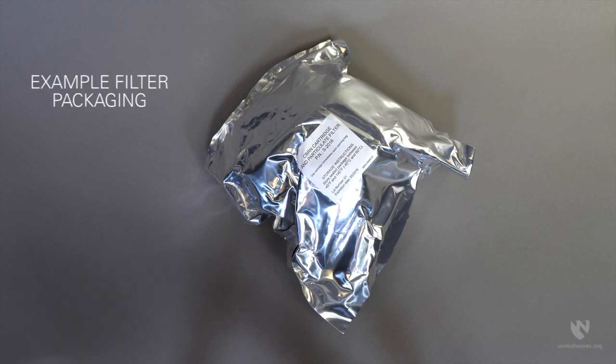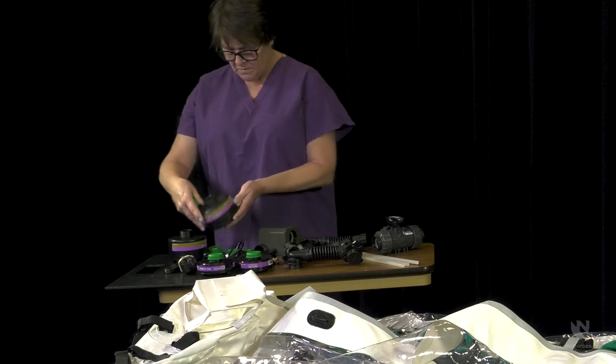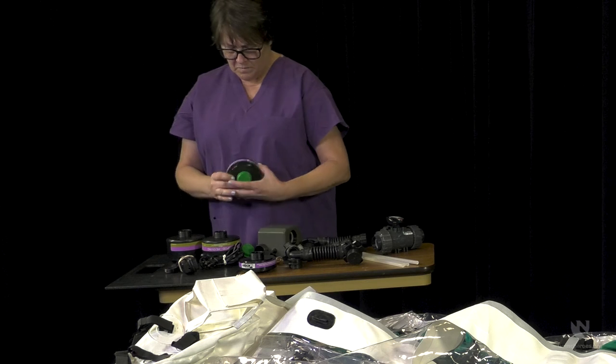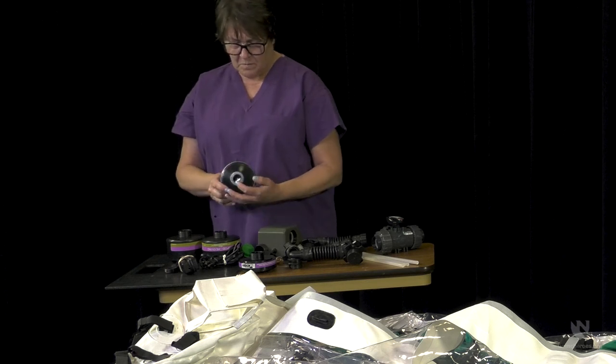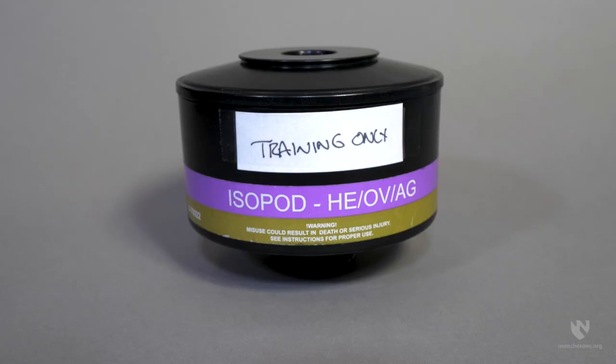Do not remove filter packaging unless you are ready to use the filter. If you are assembling the isopod for use, be sure the caps on the top and bottom of the filters are removed — any caps remaining on the filters will block air flow, which will seriously affect the functionality of the isopod. Consider using expired filters for training and label accordingly.